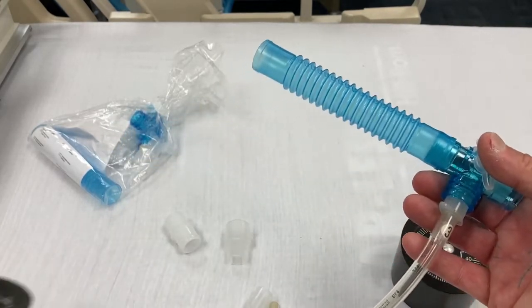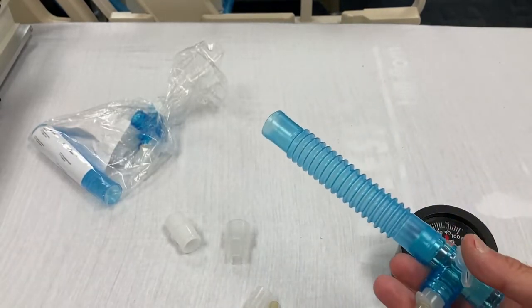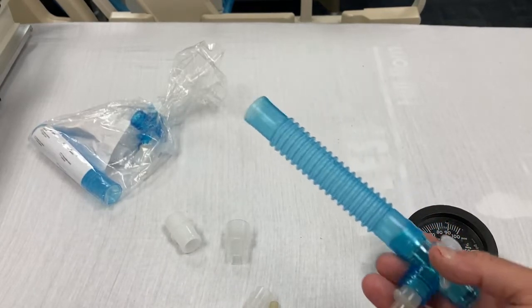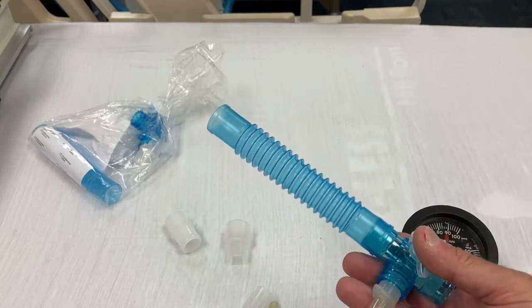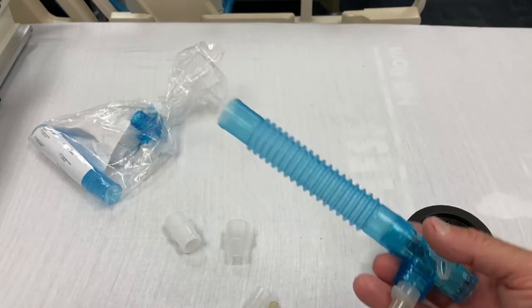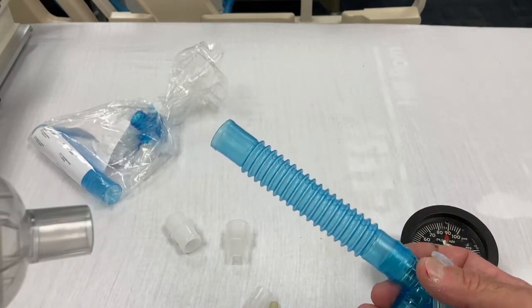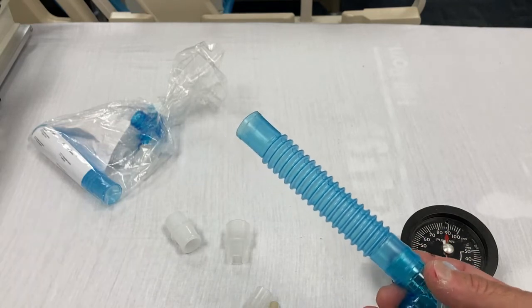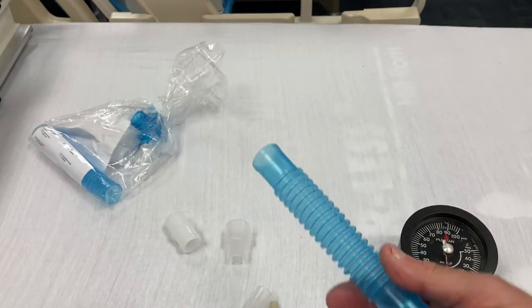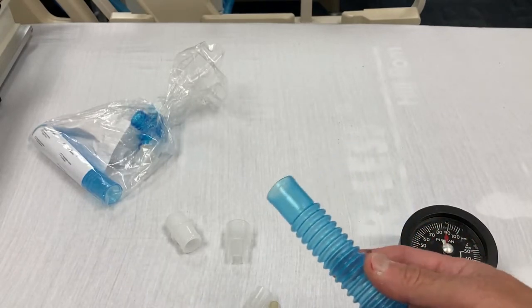So what you want to do is I tell them, first, I'm just going to take you off the ventilator, and it's going to feel pretty much like it is right now, assuming that they're in CPAP with a minimum amount of pressure support, which is probably the case in a patient that you're considering to extubate. And so you're going to gather your minute volume first. Now understand that one of the advantages of doing this on the ventilator is that they get to keep their FiO2. When you take them off, obviously, if they desaturate really quickly, that's something you need to consider. Might want to hyperoxygenate them or maybe do the parameters on the ventilator.